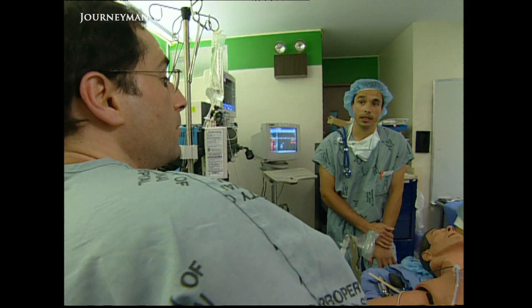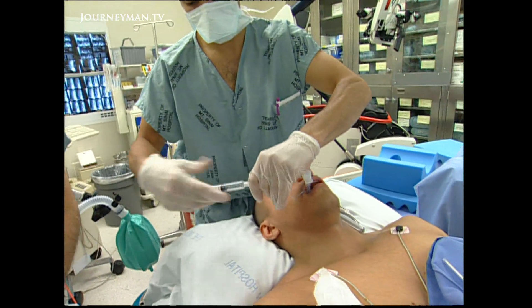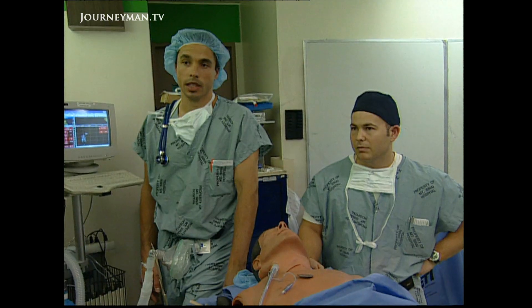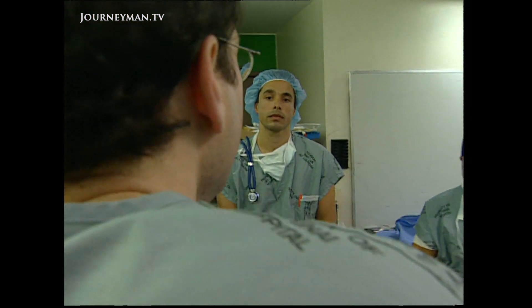From the beginning of the case, there was already trouble making a seal around the face. Dr. Baez trains under Dr. Adam Levine, both in the real operating room and the simulated one. Today, Dr. Levine presents Drs. Barlow and Baez with a crisis. Your patient is a 23-year-old male who came in this morning for a laparoscopic cholecystectomy. What they think is a routine anesthetic will go terribly wrong.